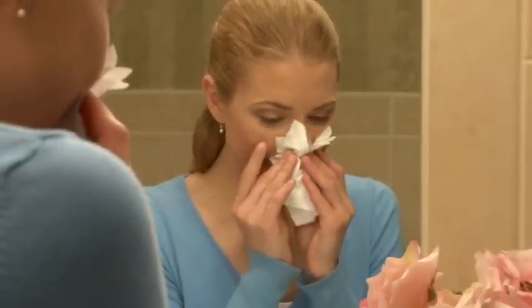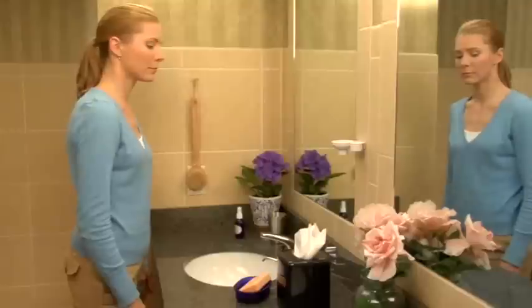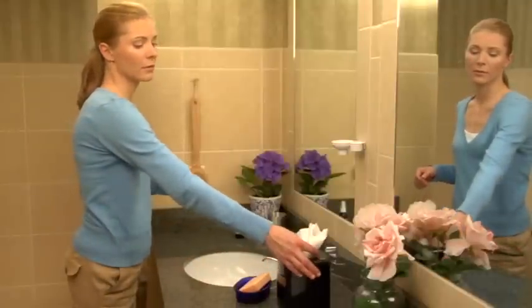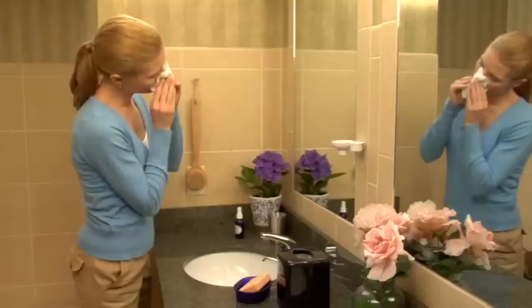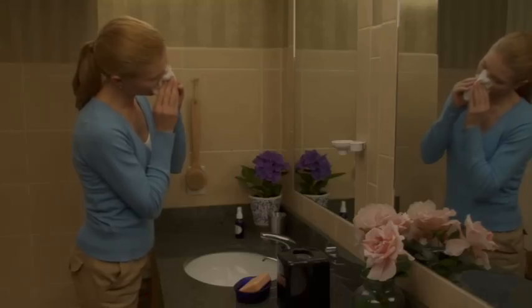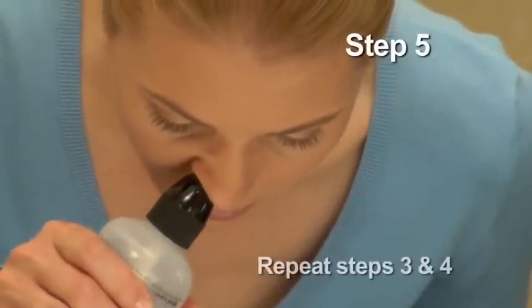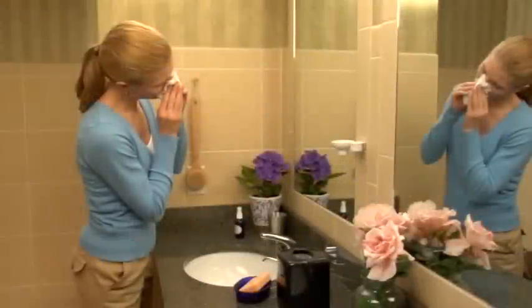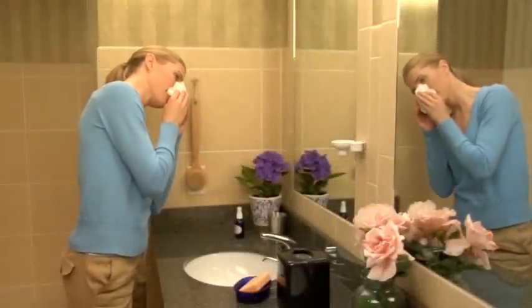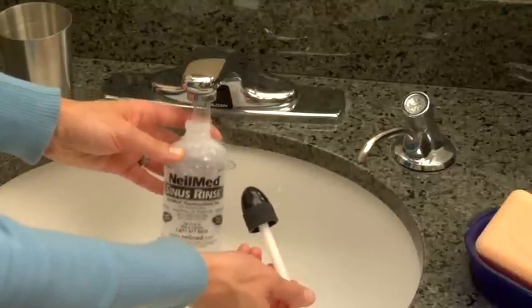Some solution will reach the back of the throat, so please spit it out. To help improve drainage of any remaining solution, blow your nose gently while tilting your head to the opposite side of the nasal passage that you just rinsed. Now repeat steps 3 and 4 for your other nasal passage. Make sure to get out all residual solution. If there is any solution left over, please throw it away.